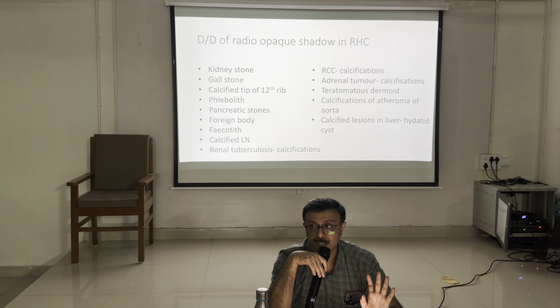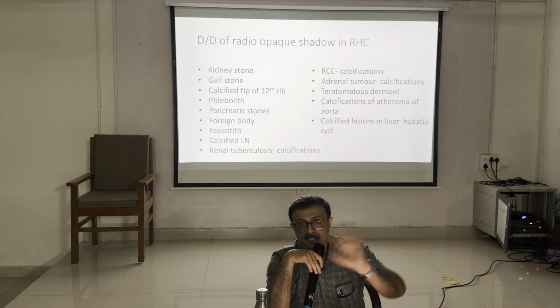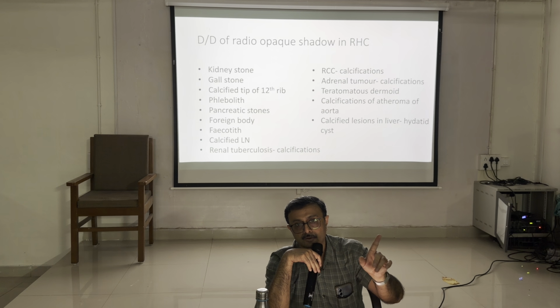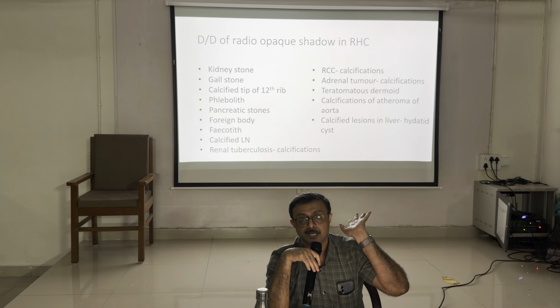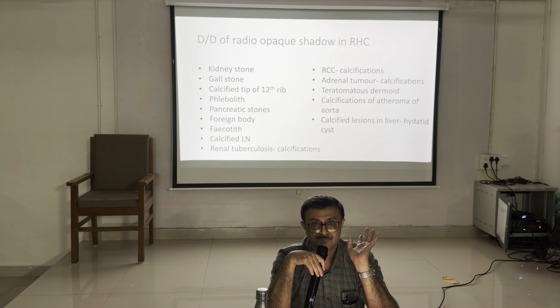Microcalcifications are very significant. If you find macrocalcification, no. If you find microcalcification, it is diagnostic.